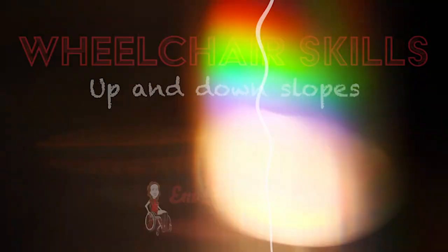In this video we are going to go through different ways to go up and down slopes in a wheelchair. When it comes to wheelchair skills, you have to find what works best for you, and that includes going up and down slopes. There are different ways to do it, and we are going to go through a few of them so you can figure out what way works best for you.